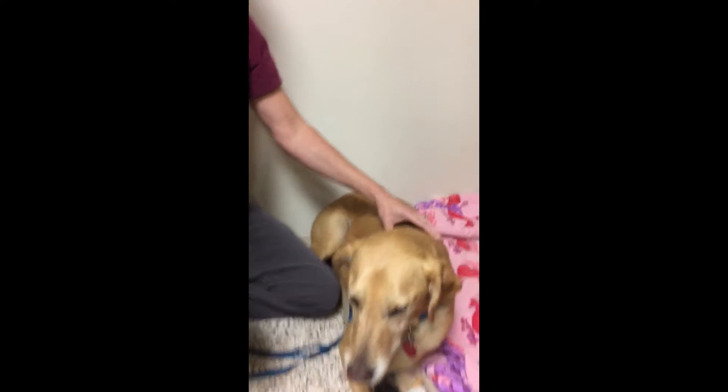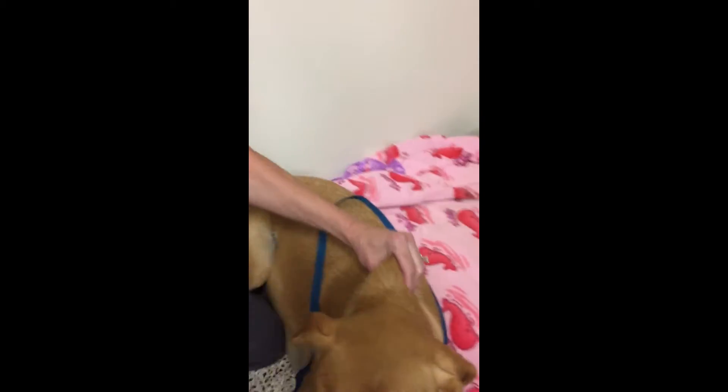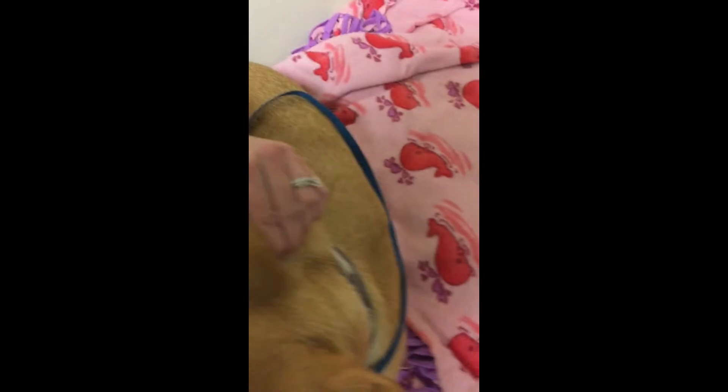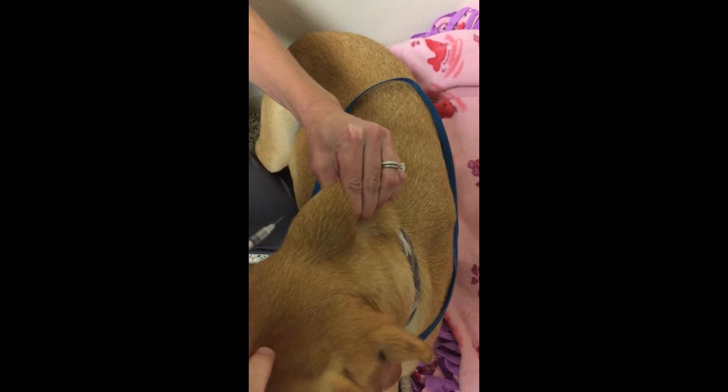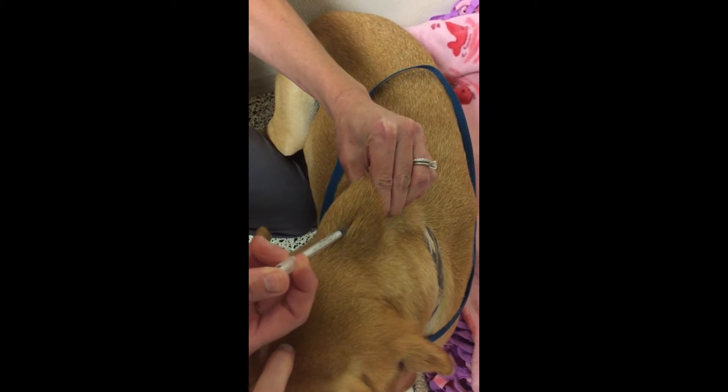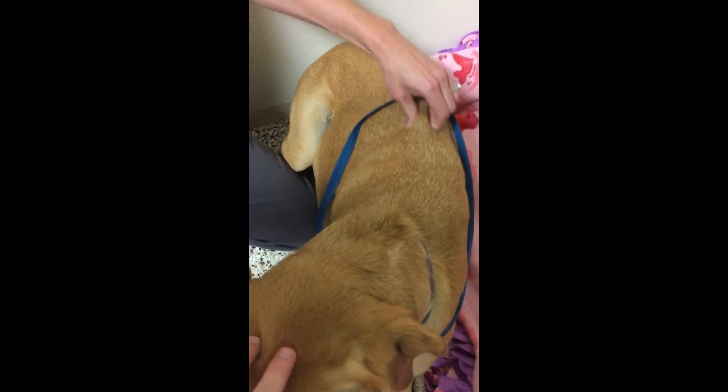This injection is given subcutaneously, which is right under the skin. You're going to tent the skin up, pick a big fold of skin, and stick your needle in between where your fingers are, then give the injection. You can do that anywhere along his back where you can tent the skin.